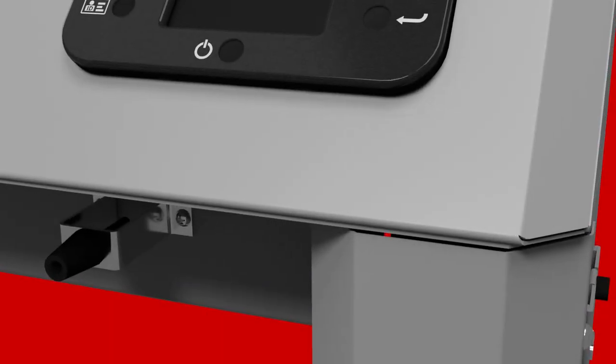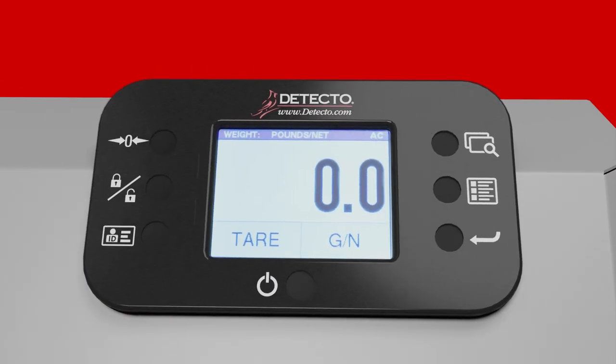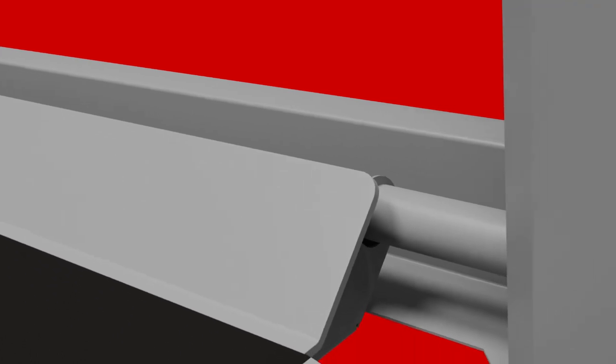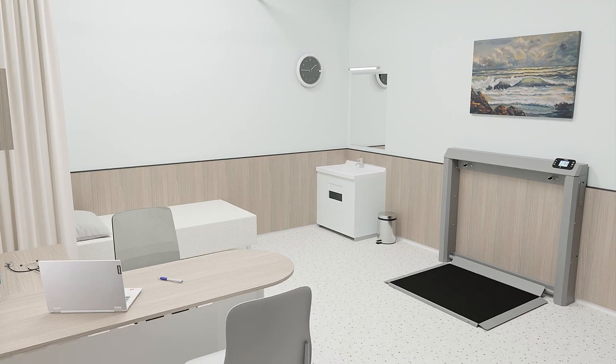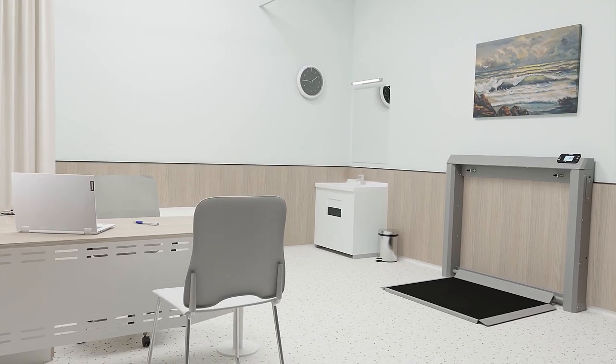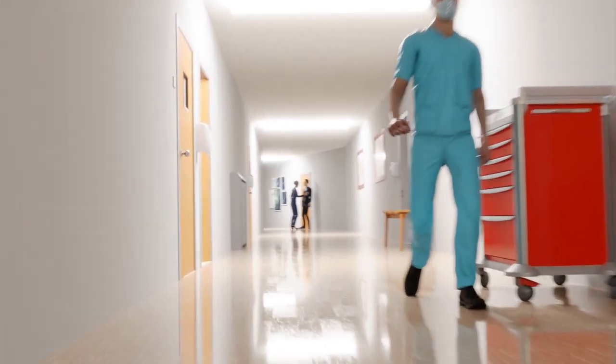The 7550's sturdy steel construction has a baked-on powder coat matte finish in a contemporary gray color to blend into any room environment and fit in more as a piece of furniture than a scale. This allows the scale to be installed directly in high traffic areas and work zones without using valuable floor space, while still looking attractive when folded up.